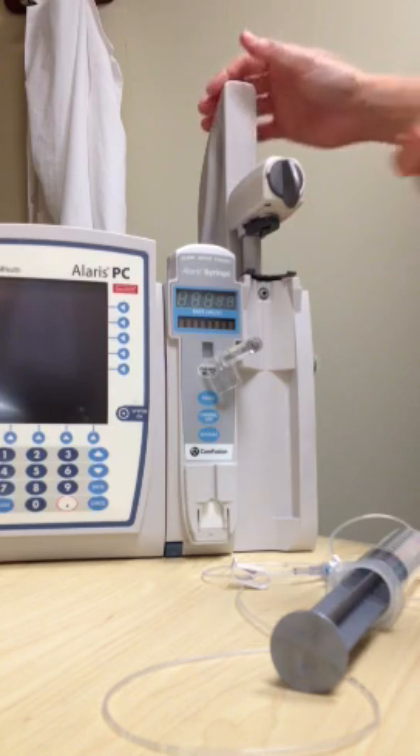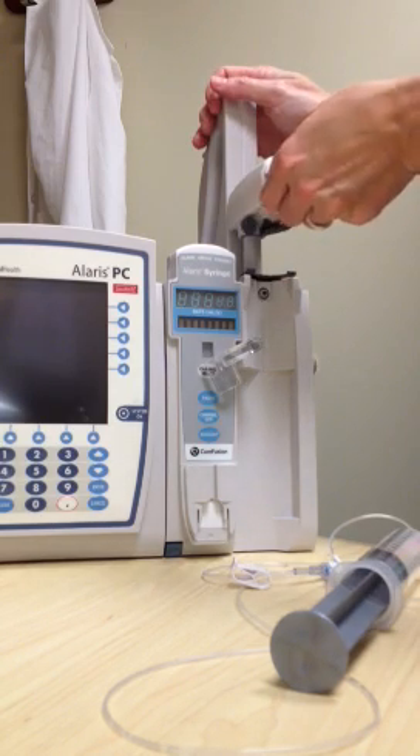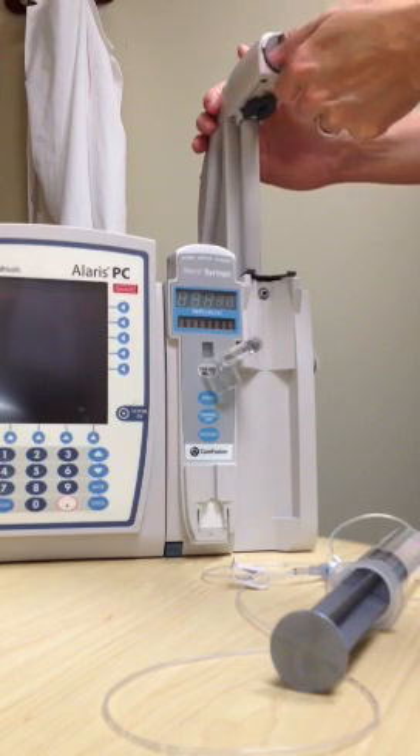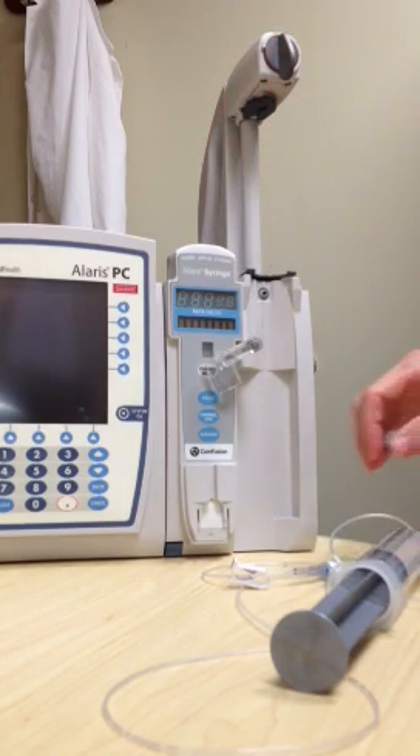Raise the drive head to a fully extended position by twisting the grip or control, raising it completely and releasing it gently.